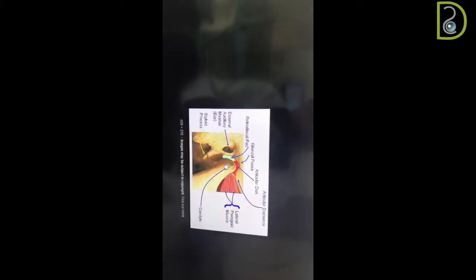Now, some studies have proven that the length of the mandible becomes longer when you use functional appliances. There are studies that say that no, the length of the mandible is the same, but you have a dentoalveolar compensation, that the dentoalveolar bone in the mandible is being forwardly positioned, while the dentoalveolar bone of the maxilla is being distally positioned. But anyway, either you get a true growth in the mandible or dentoalveolar changes. By the end, you get a class 1 dental relationship.